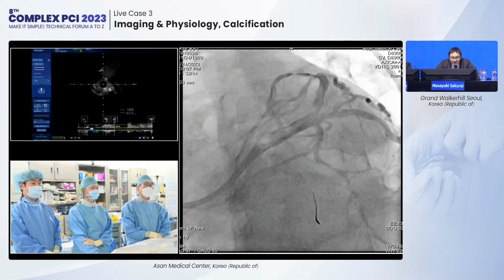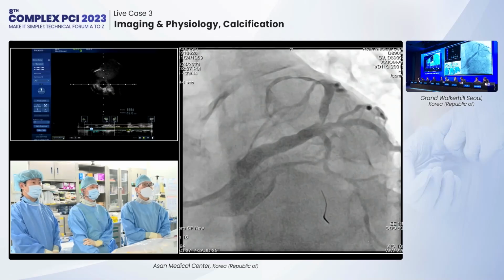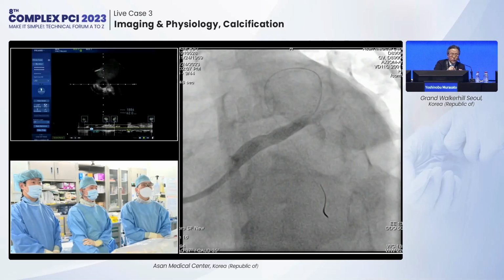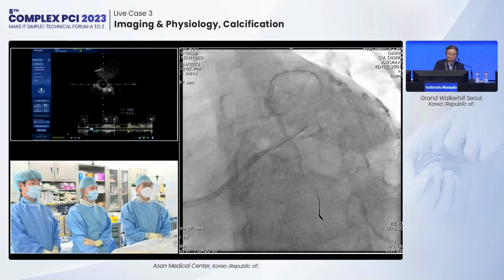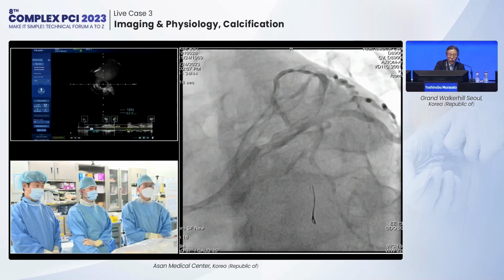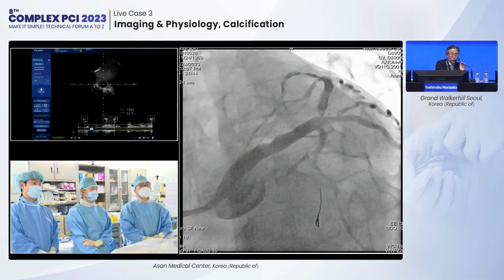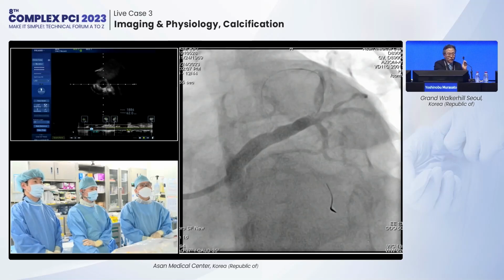At first, the guide wire crossing the CTO is intraplaque, so it is very safely dilated. And at that site, there is deep calcification, so at the CTO site, ballooning and stenting is effective. However, Japanese doctors say the LAD ostium has a serious calcified nodule, so a 2.0 mm rotational ablation is effective to ablate it, and the guide wire bias is very favorable.